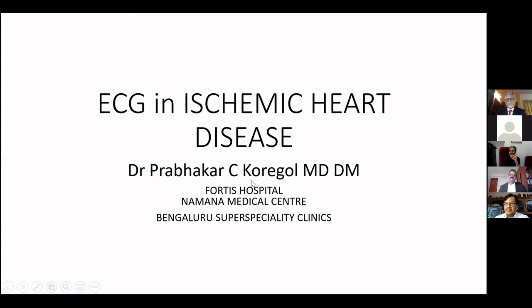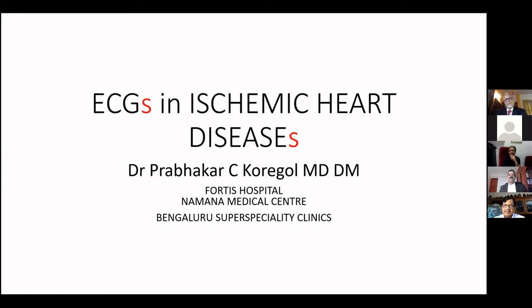So the topic that was given to me was commandments and caveats of ECG in ischemic heart disease. With the permission of the chair, I would like to add two S's to that. I'd like to talk about ECGs in ischemic heart diseases. This is because the way we acquire our ECGs has changed. It's not just the one long strip of paper that used to come, nor has ischemic heart disease remained a single entity anymore.